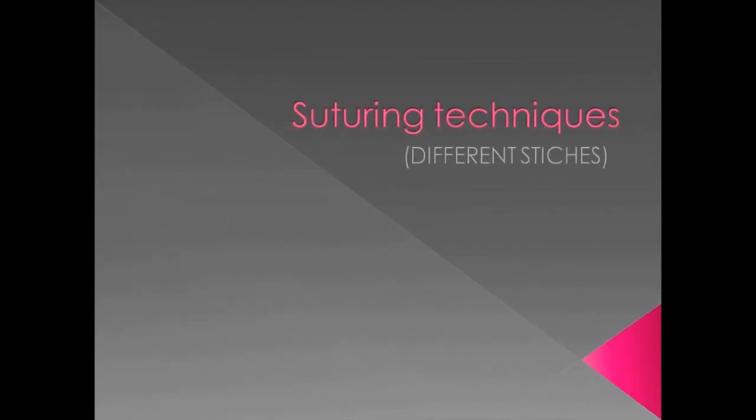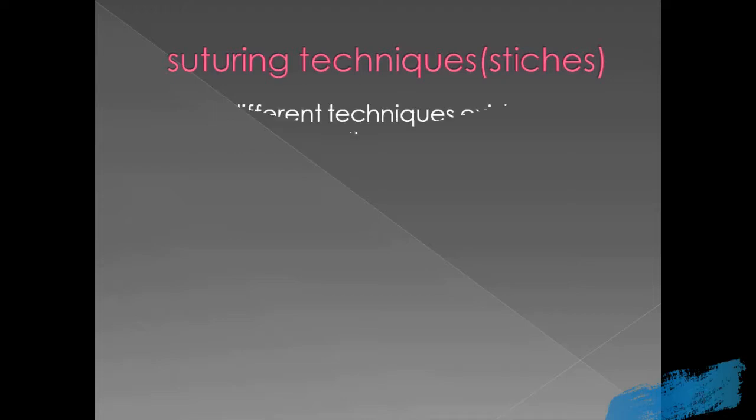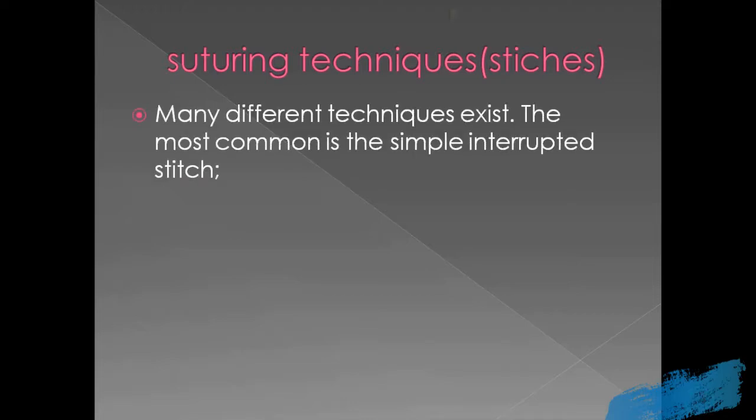Suturing techniques, different stitches. Suturing techniques or stitches. Many different techniques exist. The most common is the simple interrupted stitch.